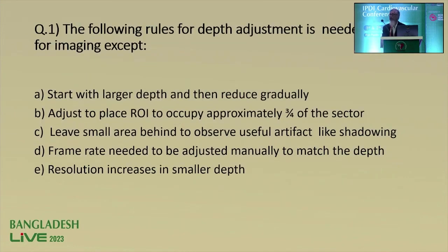So how did we start? Our first assessment is what is known as assessment as learning. This is assessment, but this is part of learning as well. By looking at this question, you are also going to learn something if you have not learned this thing before. So this was about the depth. This is a very basic thing to start with echocardiographic imaging. You get the image on the screen, and you need to increase or decrease the size, and you need to know how much you are going to increase and how much you are going to decrease. And by increasing the depth, you also get a decreased frame rate, which reduces the temporal resolution. So I have used three terms: the depth, the temporal resolution, and the frame rate. If they are not familiar to you, then you got to know what these things are about. That is how we started.